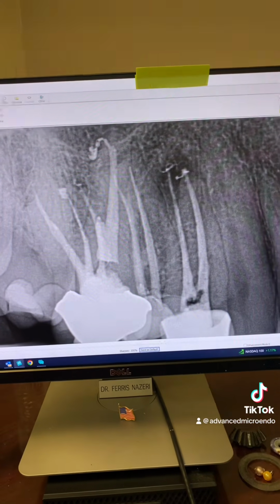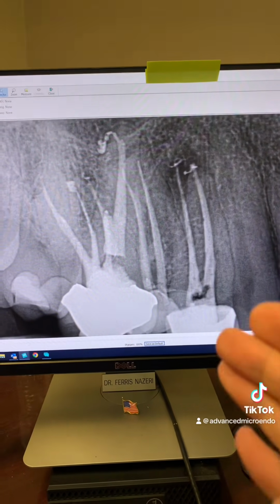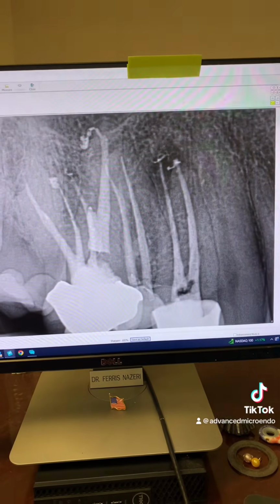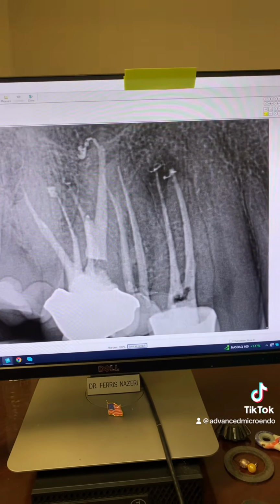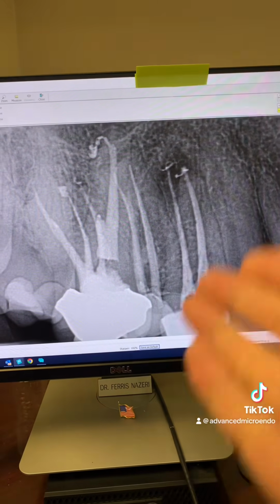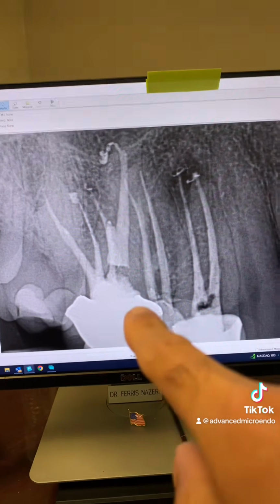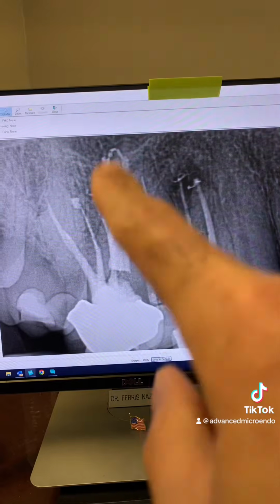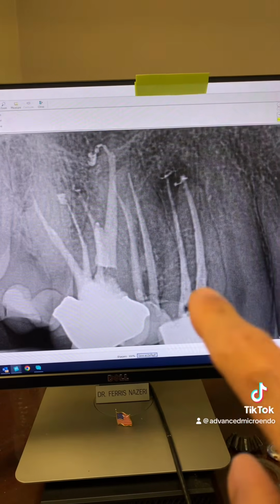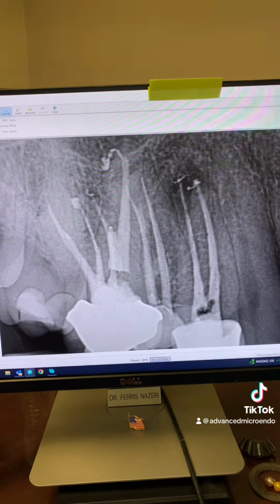We went ahead and temporized the tooth and referred the patient back to his dentist. And again, I emphasized to the patient that what I'm putting in, that temporary filling, is only good for a few weeks, not a few years. And I made sure I put that in the report to the general dentist as well. But anyways, everything went great. And again, this is 2 years post-op of tooth number 3 that we did the root canal on. You can see those periapical radiolucencies healed completely, and I'm optimistic for tooth number 5. I'm optimistic that the same thing will happen, so this periapical radiolucency will heal in a few months.